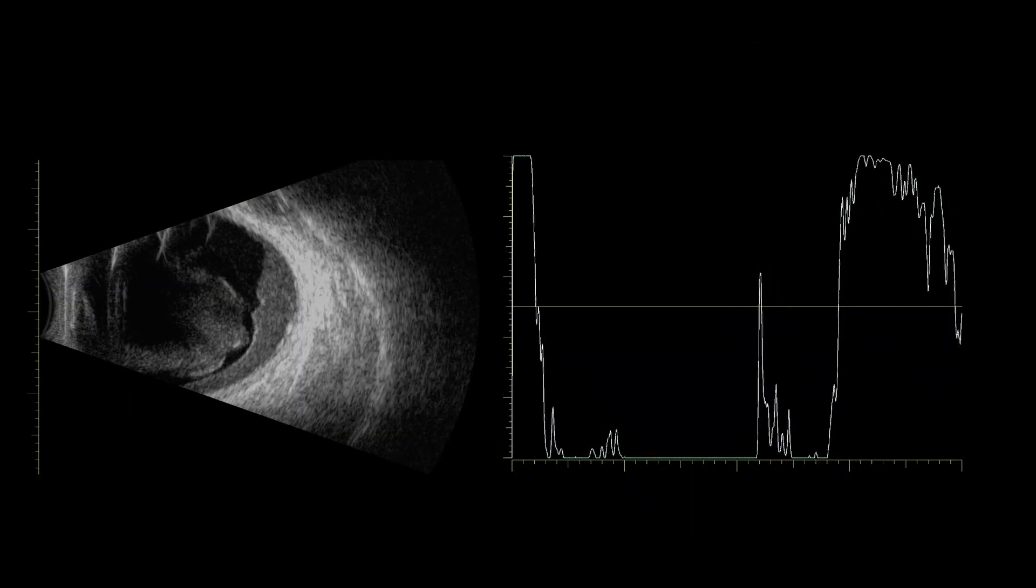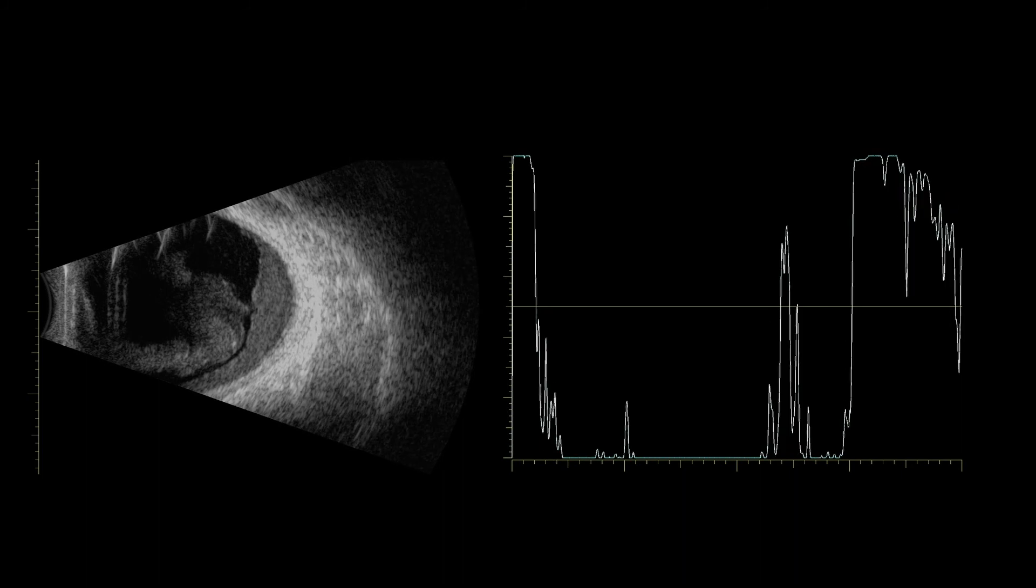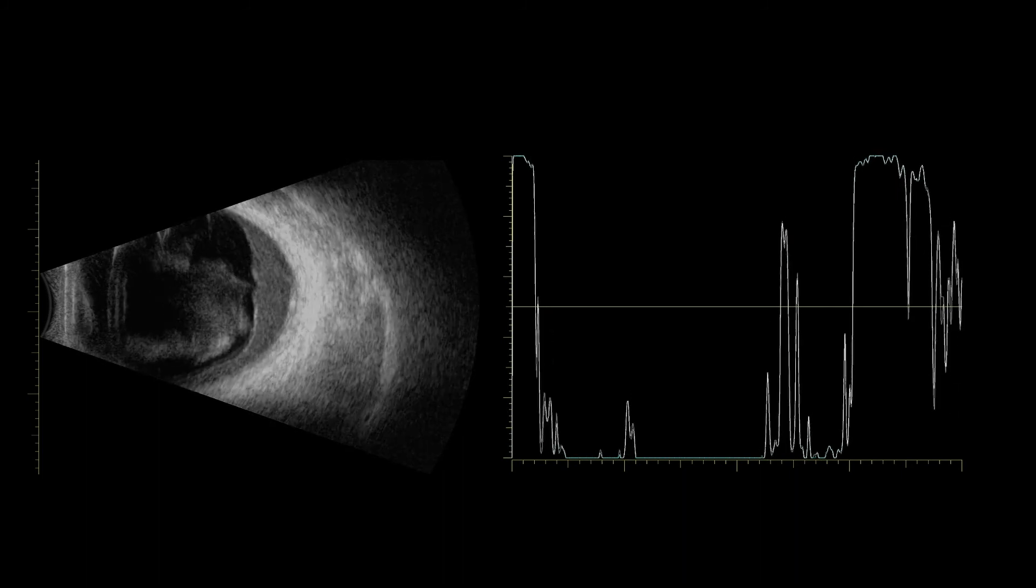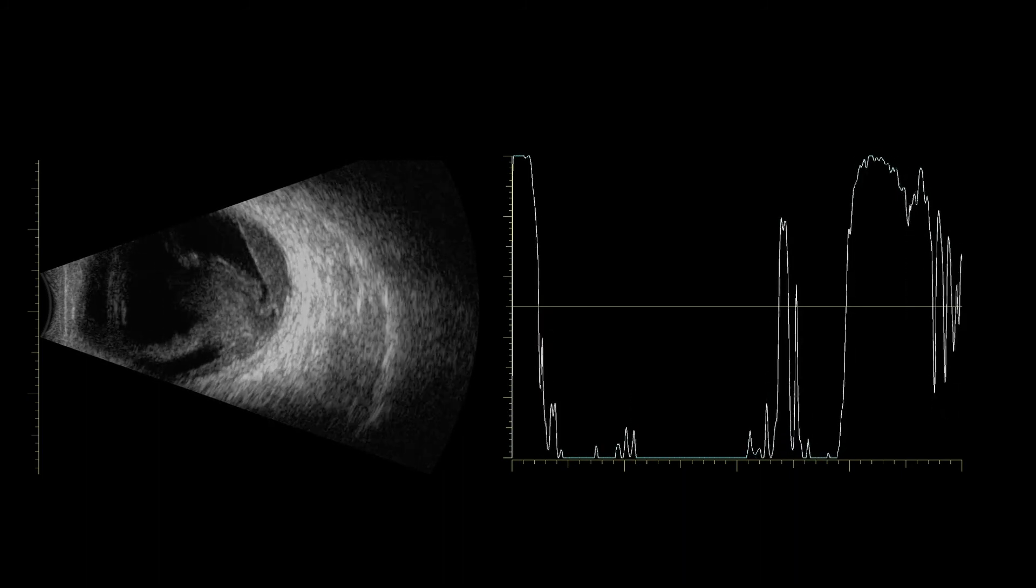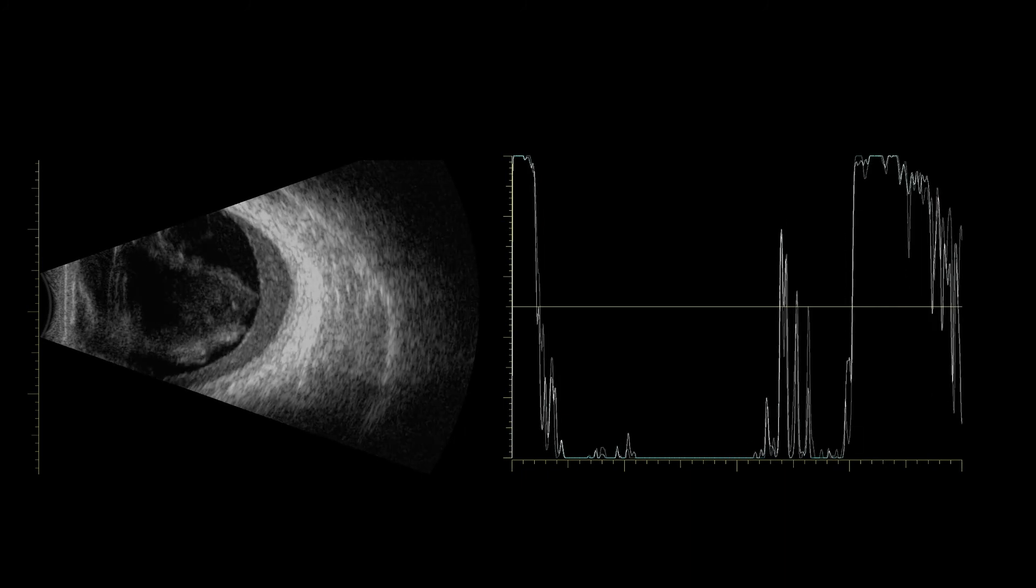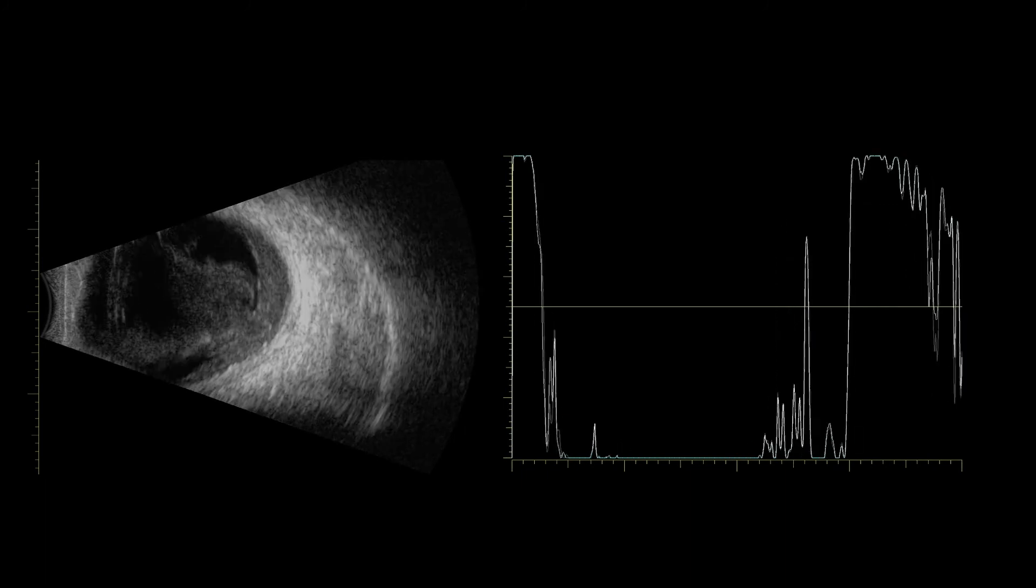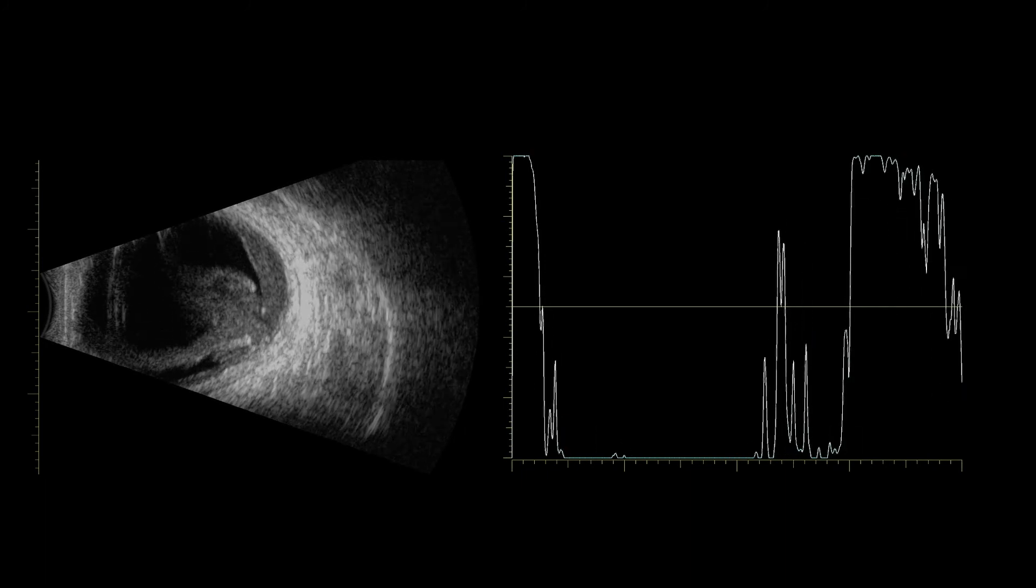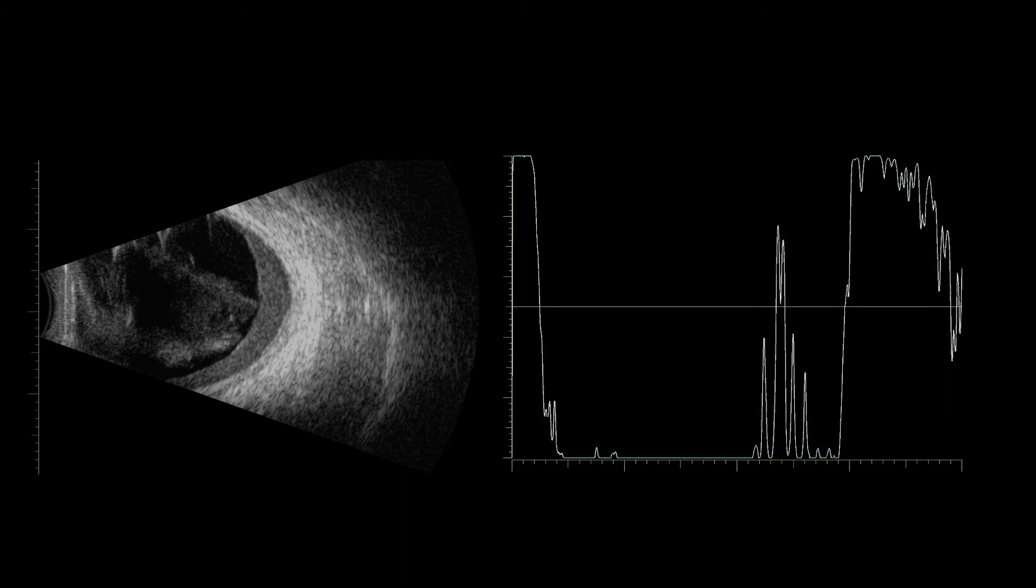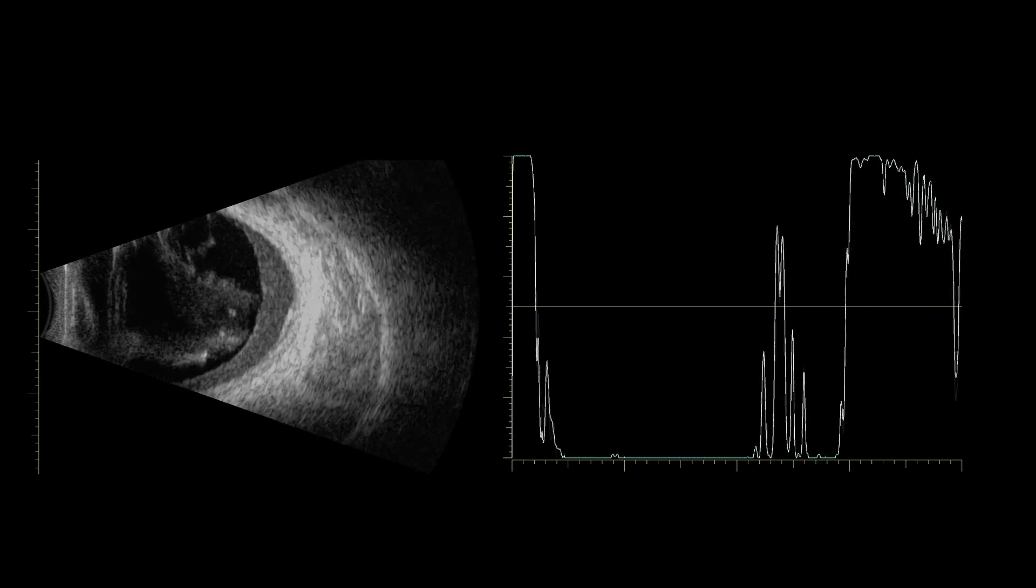Vitreous membranes vary in density. On B-scan, they generally exhibit a smooth outline and marked mobility, and may remain adherent to the optic disc or near its borders. On A-scan, vitreous membranes usually do not produce a maximally high signal, and the spikes will move significantly as the patient's eye moves.